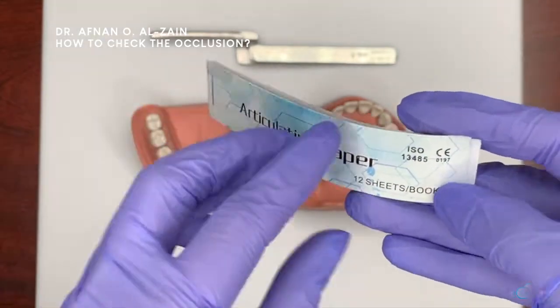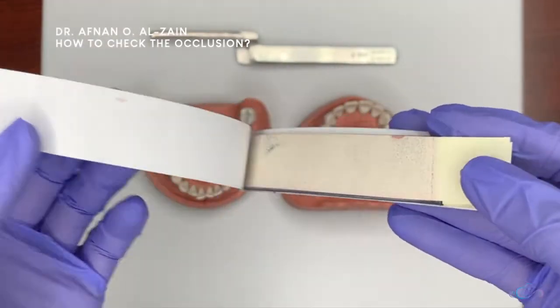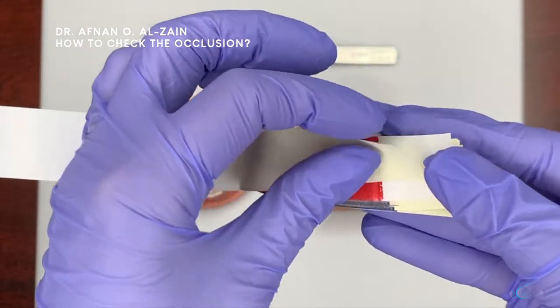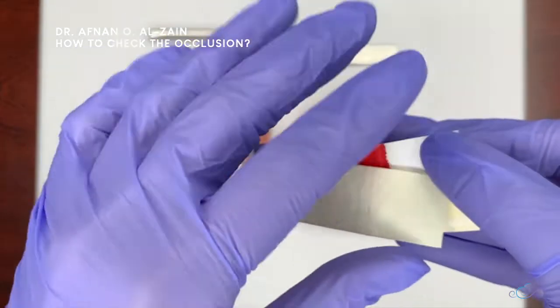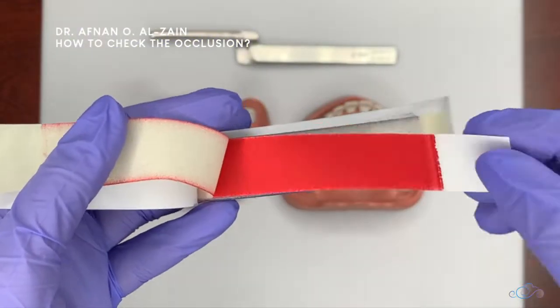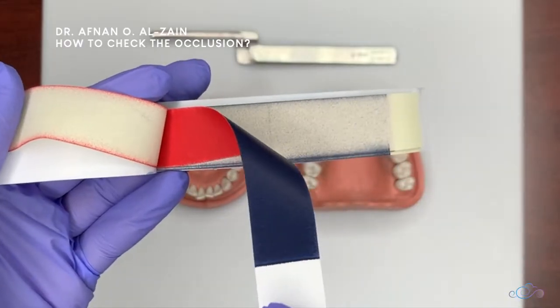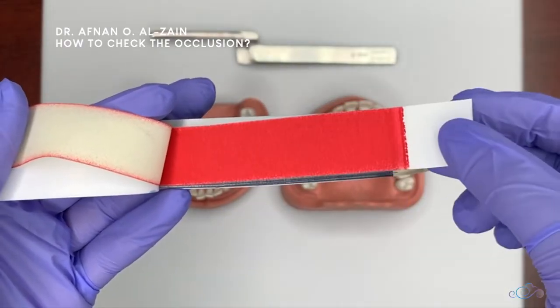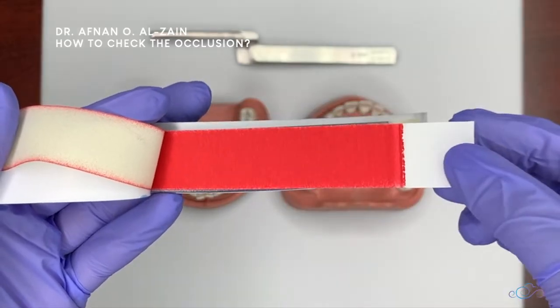We check occlusion using the articulating paper, and typically it comes in a booklet. You can see it has clear sheets that we're not going to use, and then there is the carbon paper. Sometimes it comes in one color for older booklets, or as you can see here, it comes in two colors.